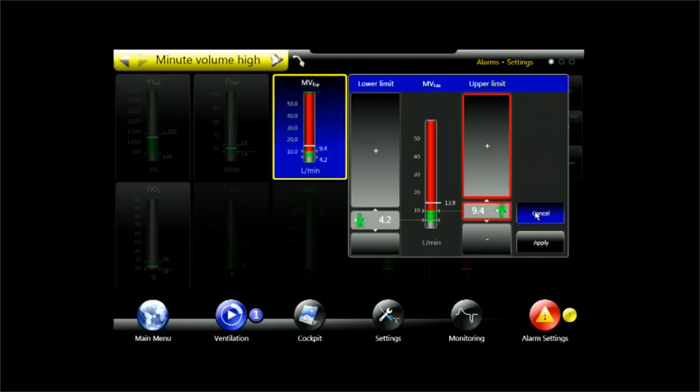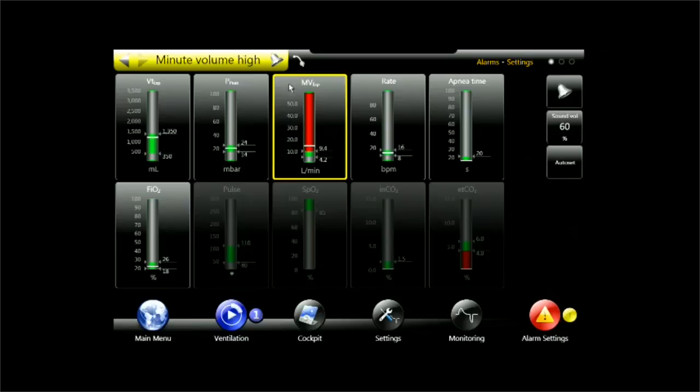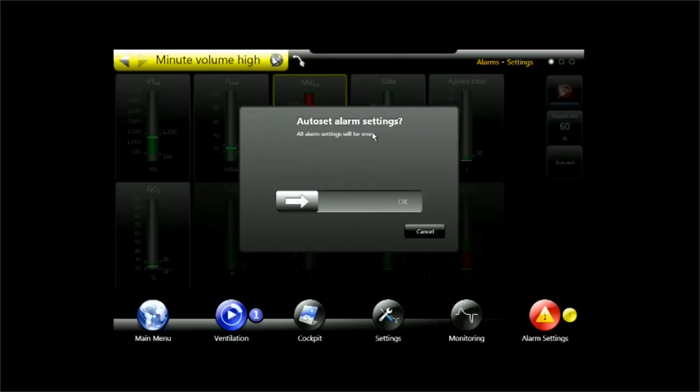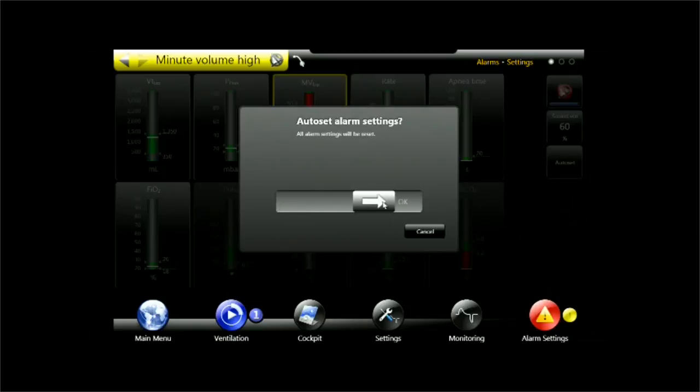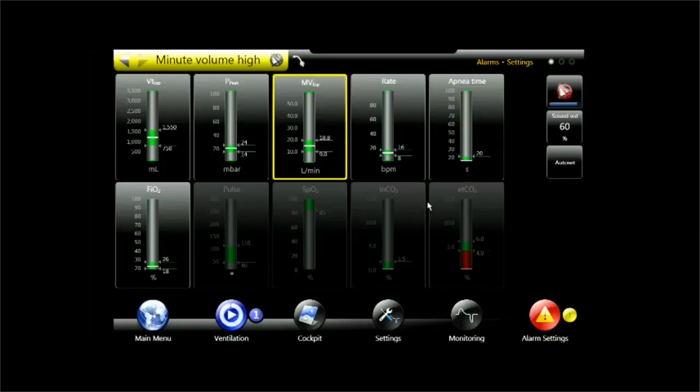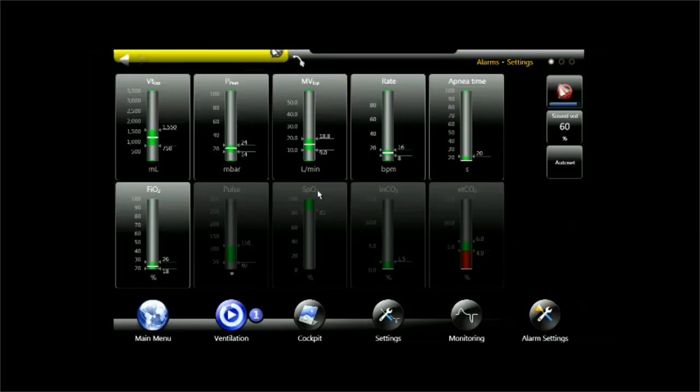Let's see what happens and it will do with all the alarm limits. AutoSet, it gives me a warning, all alarm limits will be reset. I confirm that and I see that all the alarm limits are now around the white line. The white line is the current value.